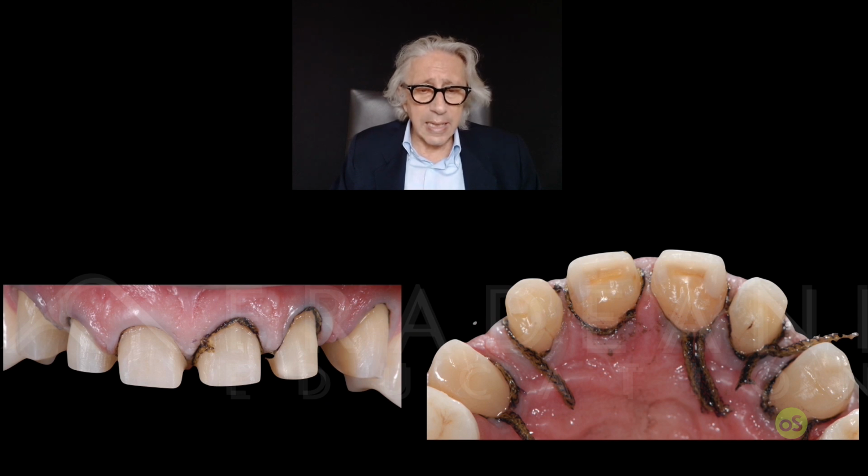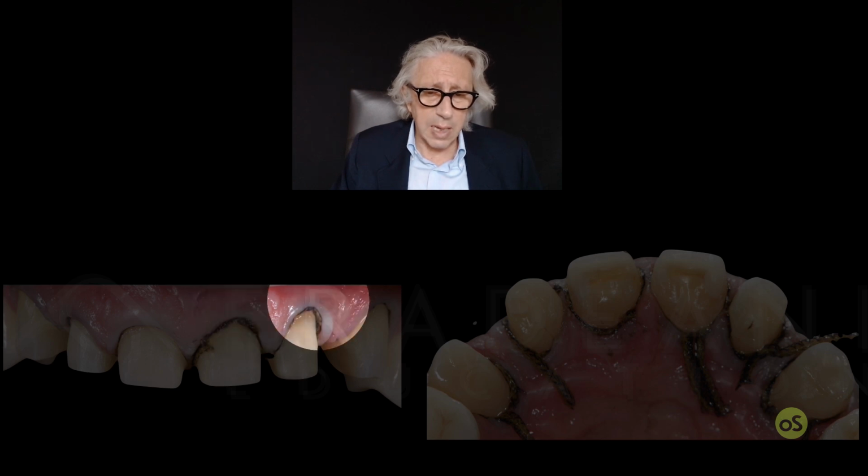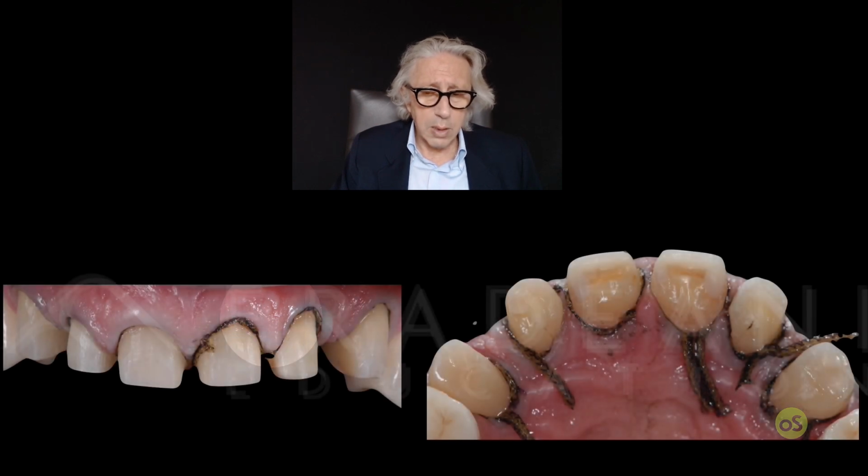So you can understand that buccally you have enamel everywhere on the back side, except this area where you have dentin already, as we said before. You see the second cord is not put inside because we don't need to arrive to the gingival line. We will maintain our margin supragingival on this and this tooth, both of them.